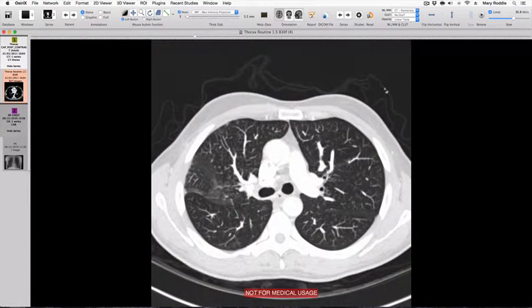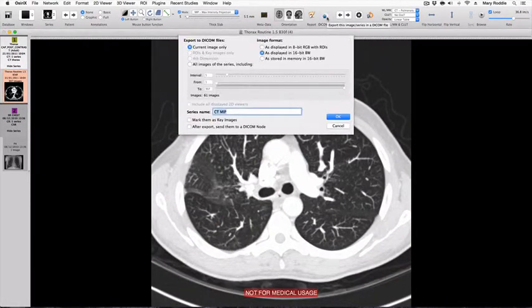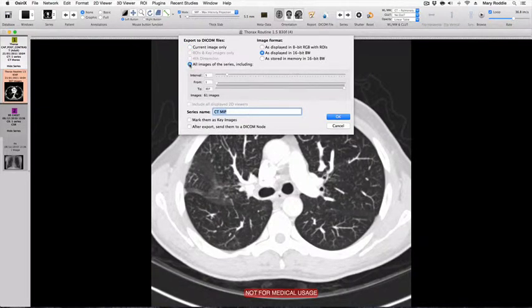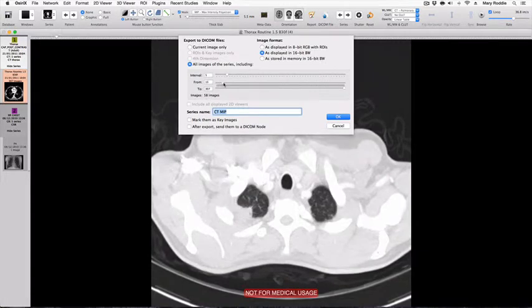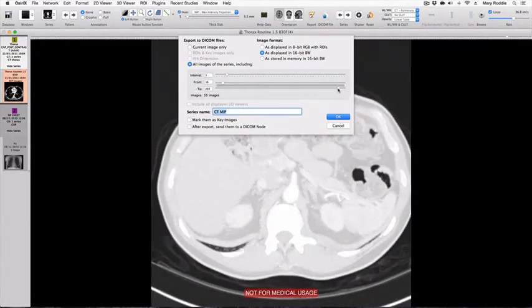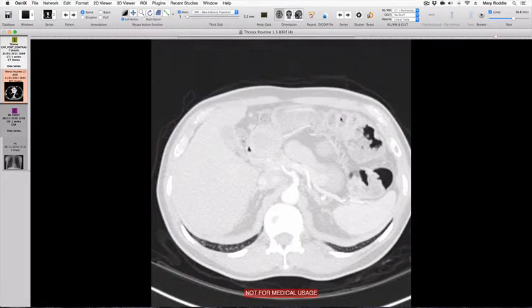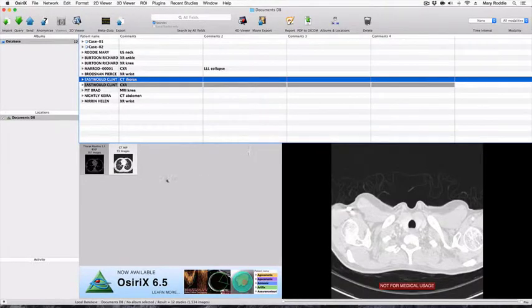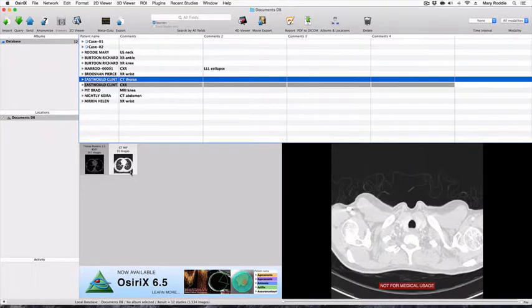To export these MIPs as a new series simply go to Export to DICOM, select all images of the series and decide where you would like the series to start and finish, and then press OK. If we now go back to the database window we will see that in addition to our original axial series we have a new series of 55 MIP reconstructions.